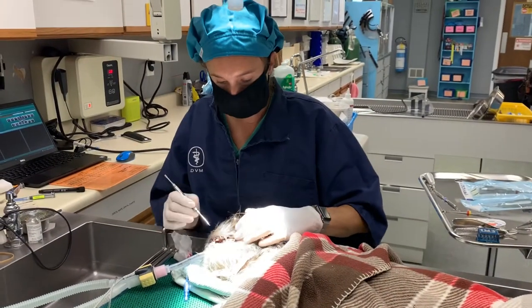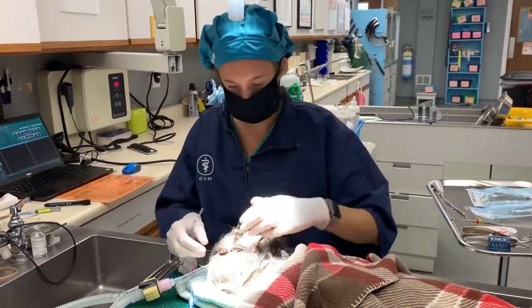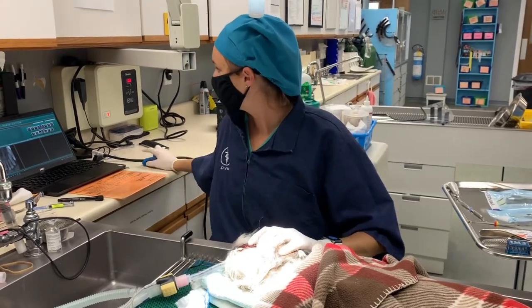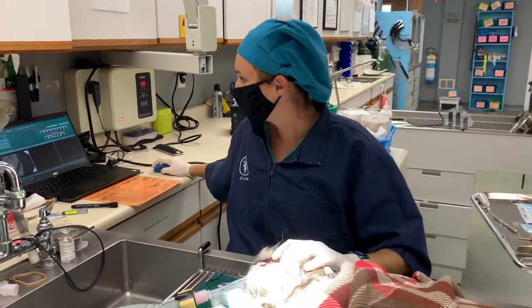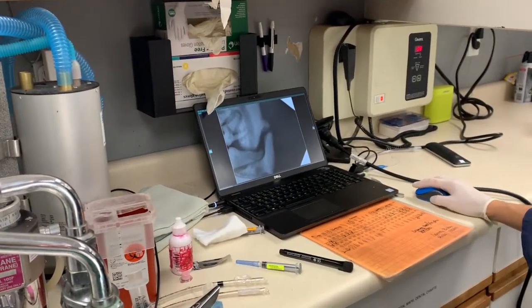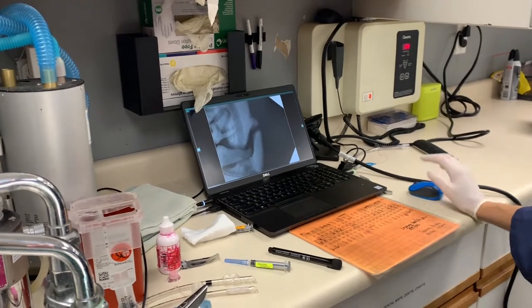During routine dental work, owners noticed that he's been looking at his mouth a little bit weird. On x-ray, we're just getting started here, and this guy unfortunately has a jaw fracture. We can see it here in the back part of his mouth. This is a sequela of all of these teeth being diseased and abscessed.